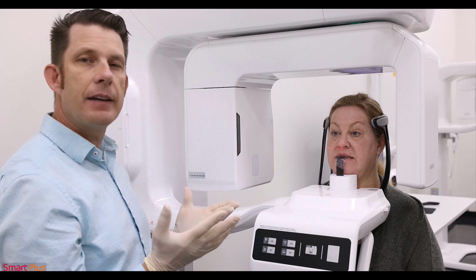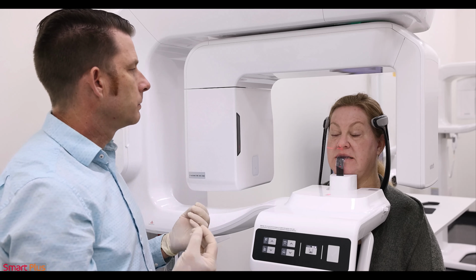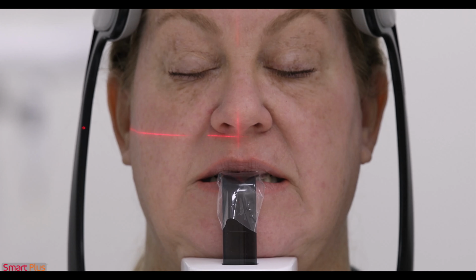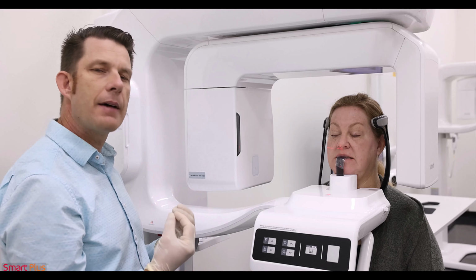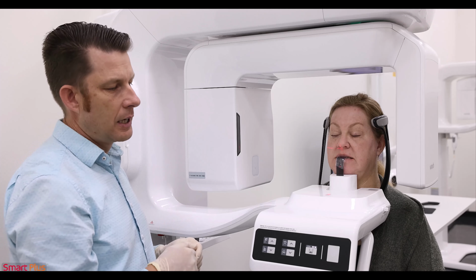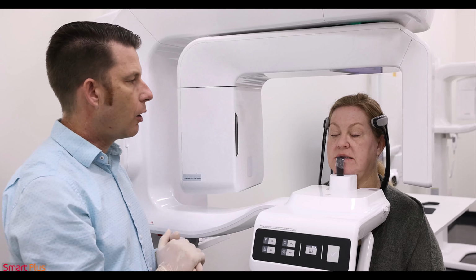And the instructions I give to the patient are that I would like them to go ahead and close your eyes, just relax and breathe through your nose. And also tongue position. With CBCT, we can just have the patient relax their tongue. Next, I'm going to hit my check mark, which is my ready button on the machine.